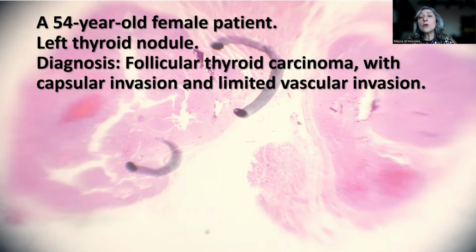Remember that with vascular invasion, you have to see large vein invasion outside the capsule. You have to have the thrombus that is attached to one side of the wall, usually lined by endothelium, and frequently the thrombus might contain fibrin as well. If you want to support your diagnosis, you can do immunostain, in particular CD31, which would highlight the vascular outline as well as the endothelial capping over the thrombus.